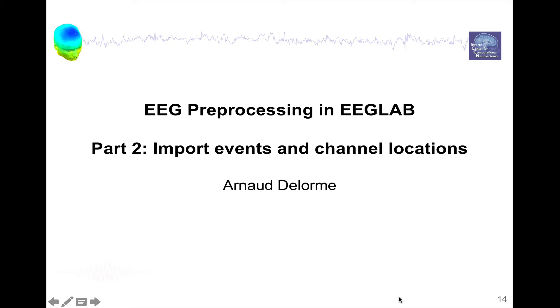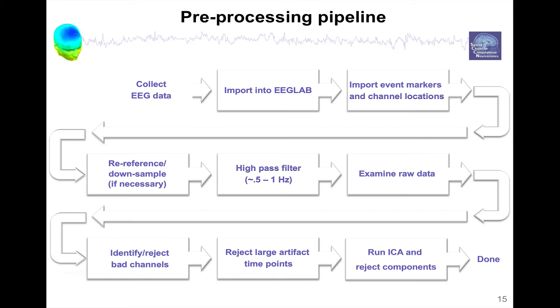Hello, my name is Arnold Delorme and this is part 2 of EEG preprocessing using EEGLAB. This part is about importing events and channel locations. We saw part 1 was about importing into EEGLAB and now we're at part 2.